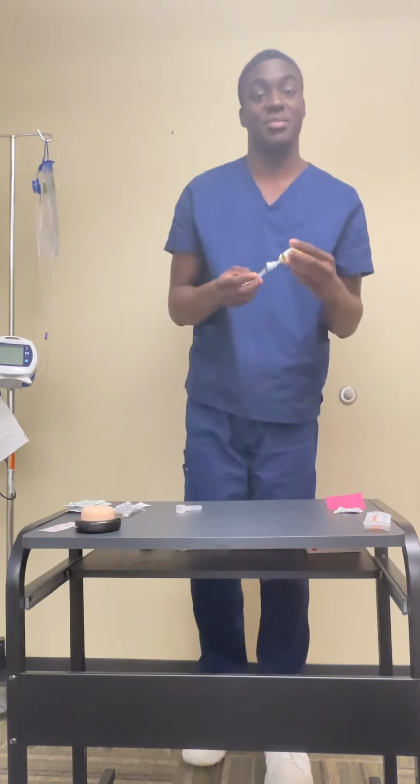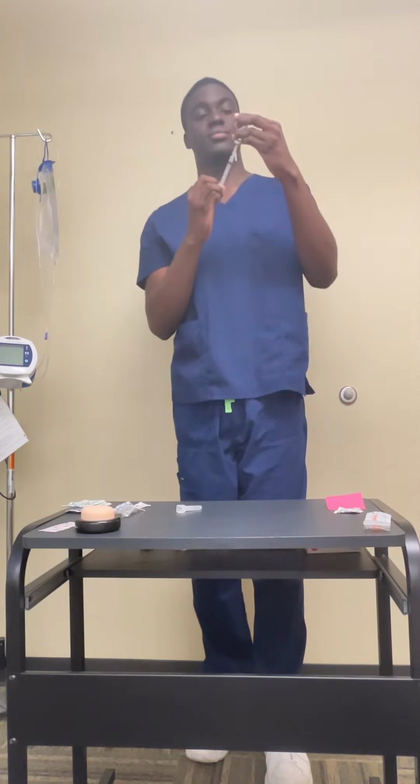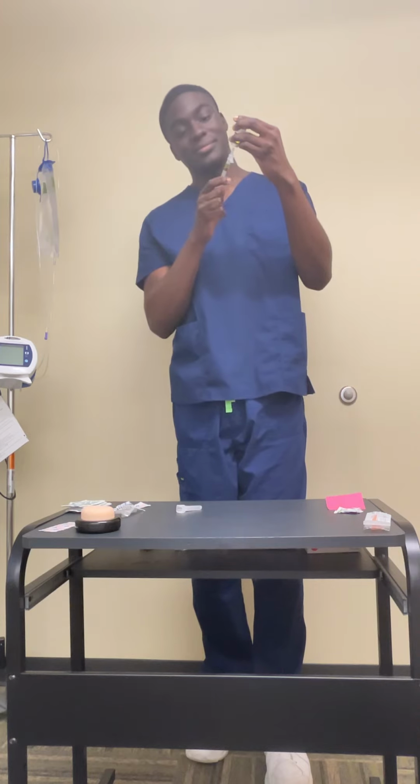I would inject air, but there's already a lot of pressure in here, so I'm just gonna take out my 1 milliliter, just so it doesn't spray everywhere.